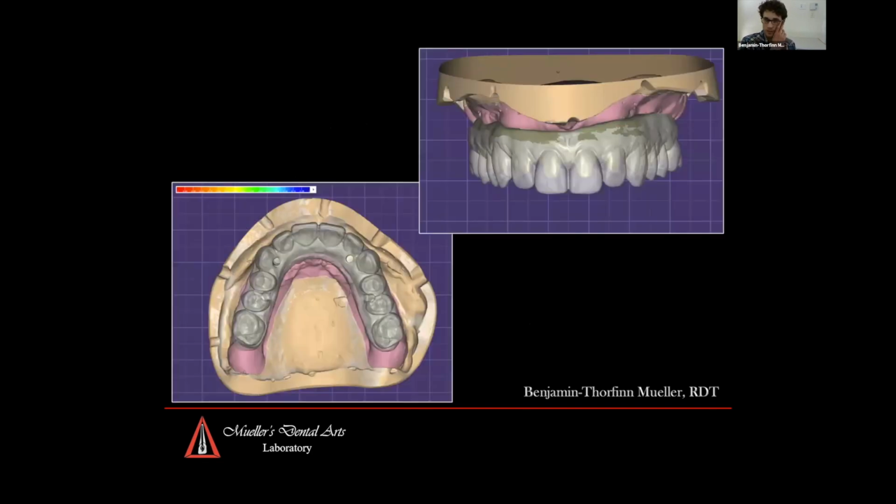For Alma, we chose to go with a titanium thimble frame with lithium disilicate crowns. I'll start off with how we started digitizing the case. Once everything was approved in terms of the diagnostic setup, we scanned everything in on our DOF Freedom HD scanner, meshed everything together, and started designing the thimble frame into the diagnostic setup.